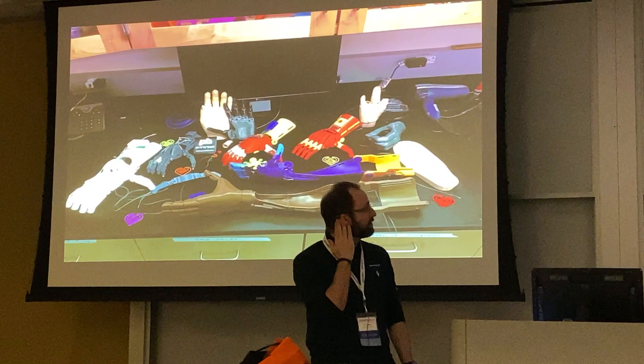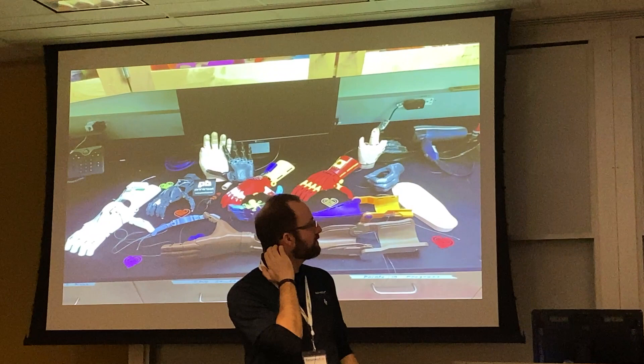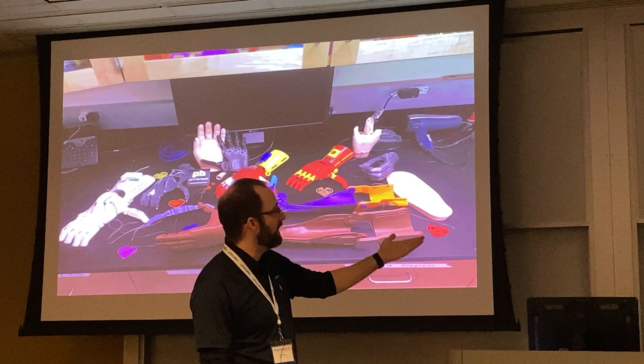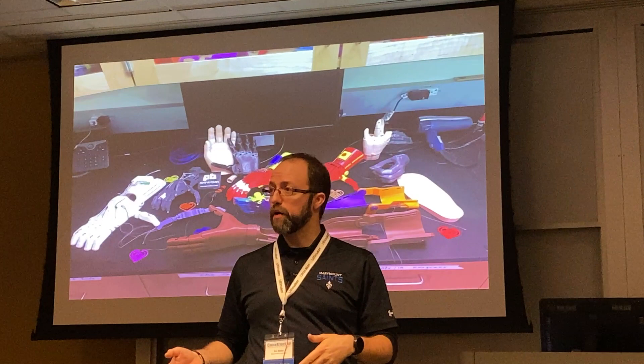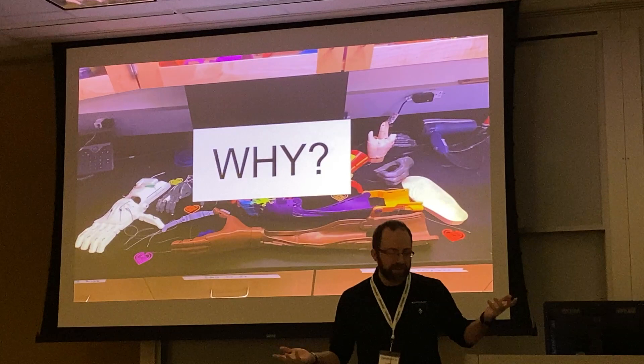We've got lots of different devices — these are all ones printed in my lab. There's a wide variety: the big white one is the Raptor Hand, one of the more original designs; the big brown one is the Kwawu Arm; and there's the Unlimited Arm. Not all are e-NABLE designs — the black hand is a flexible hand design by Open Bionics, who created the first FDA-approved 3D-printed arm that works with myoelectrics, with plans freely available online.